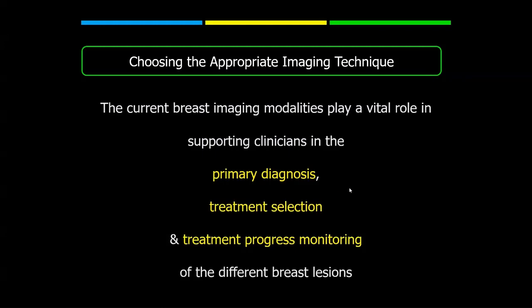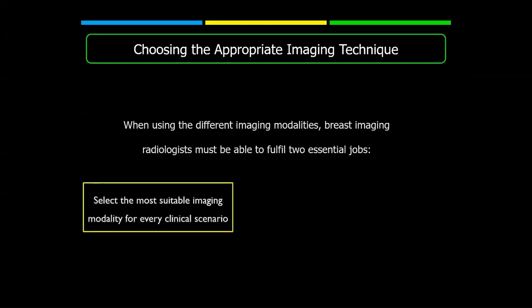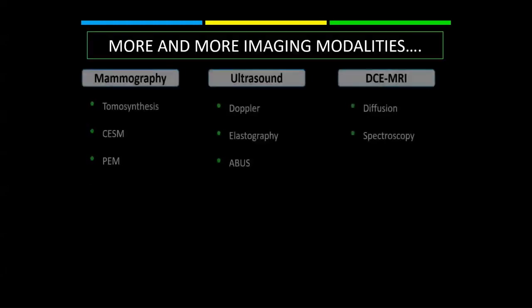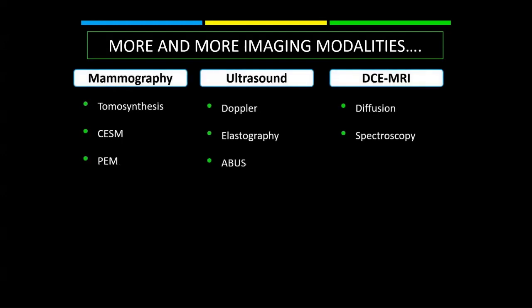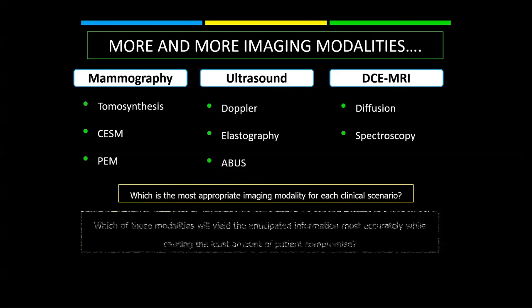And actually, when using the different imaging modalities, breast imaging radiologists must be able to fulfill two essential jobs. They must be able to select the most suitable imaging modality for every clinical scenario, and at the same time, they must be able to provide competent interpretation and reporting. And now that we have more and more imaging modalities in hand, it has become a real challenge to choose which is the most appropriate imaging modality for each clinical scenario.